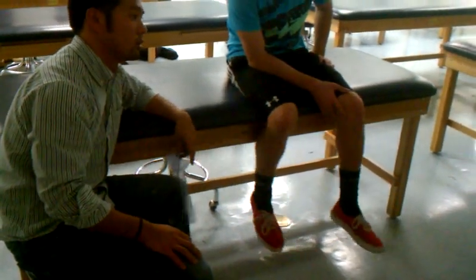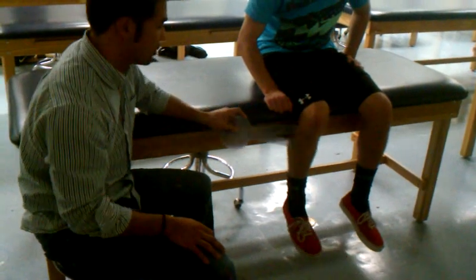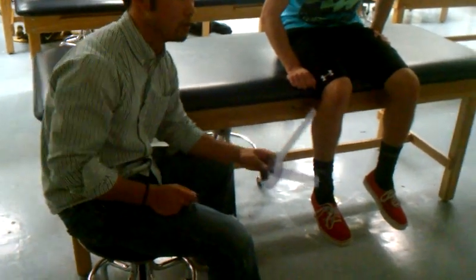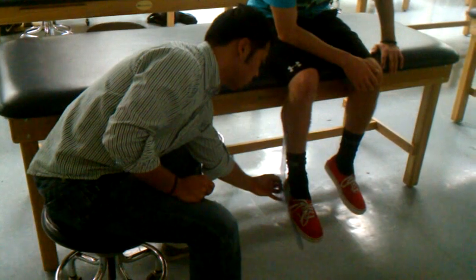For plantarflexion, the stationary arm points along the fibula toward the fibular head, which bisects the lower leg. The axis is the lateral malleolus. The moving arm follows the fifth metatarsal. Starting at neutral, he punches the foot as far down as possible — he goes down and, starting from zero, he has 40 degrees. People get confused and think he has 130 degrees of plantarflexion — no. If you're starting at zero and following it down, it's 40.